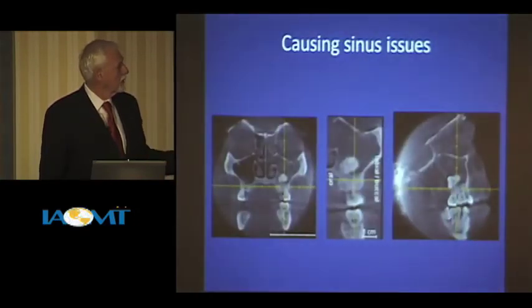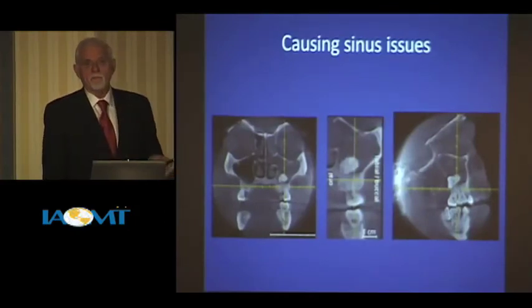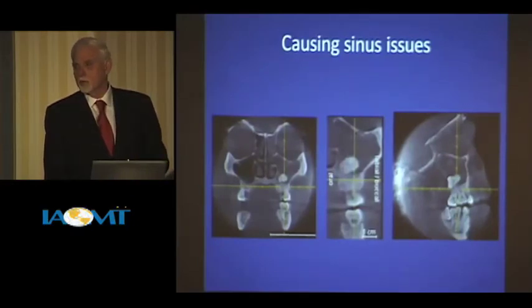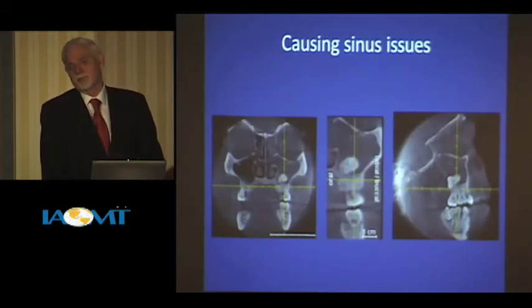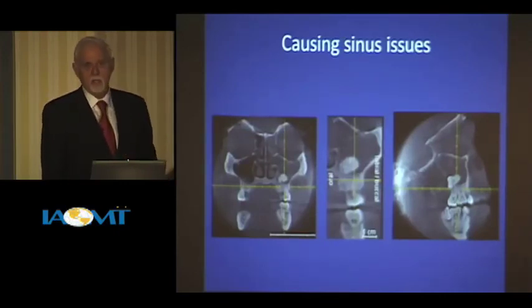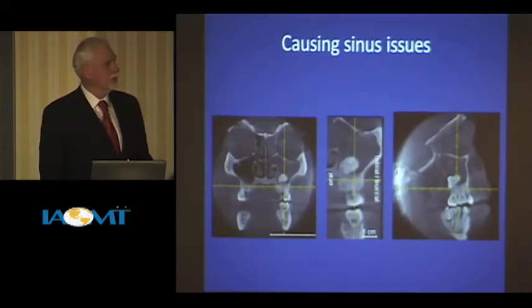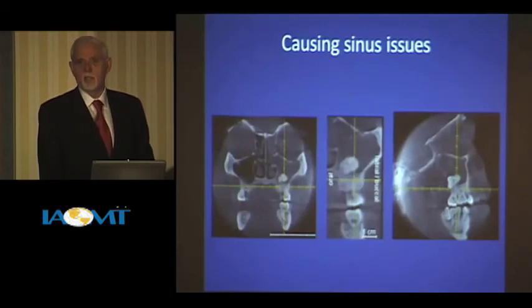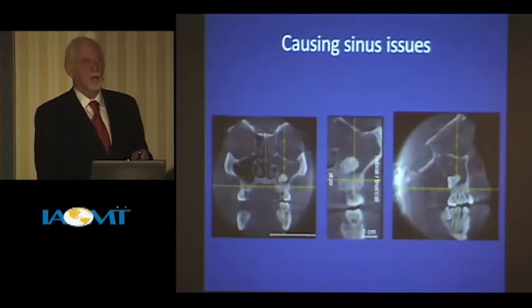But look at it over here. You might see if somebody's got another. Look at this right here. Look at the sinus. I've done at least 6,000 third molar extractions on young people. Today, would I do that? Today I wouldn't. Any one of you out there could say, I just think the chances of that ending up in the middle of the sinus could wreck my morning or afternoon. It's not going to be life-threatening, but all of a sudden now you're in trouble. So all it tells me is, beforehand, keep me out of trouble.